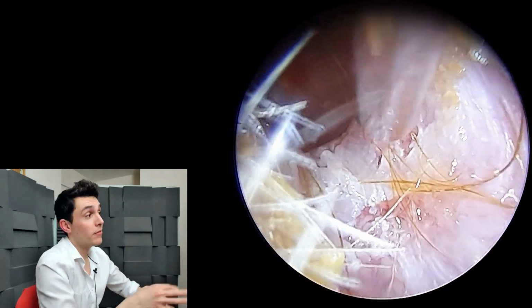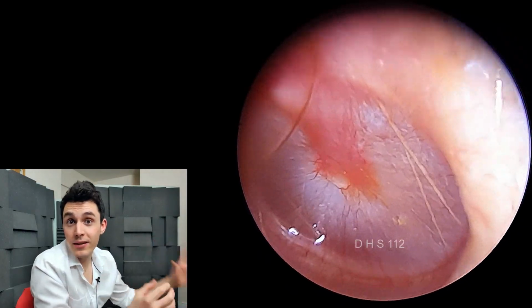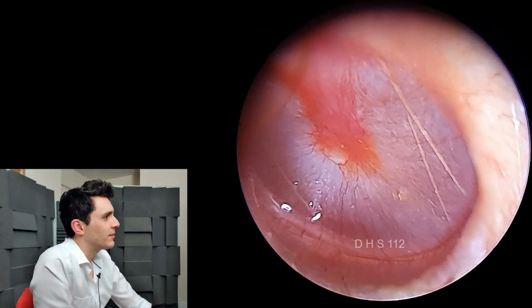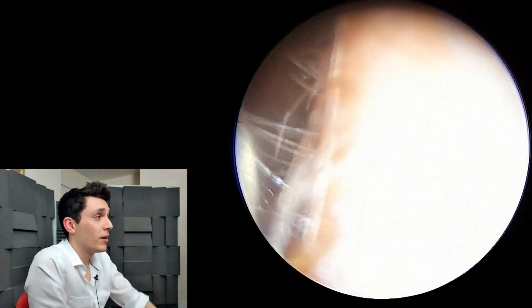So we're really just trying to prevent any kind of further infection. And consequently, after I performed this procedure, I popped the hearing aids back in, and he was in the land of the living. He could hear again, which he was extremely pleased about. So a little bit of fluid there, that's just some residual sodium bicarb, so nothing to worry about there. But there we go. I thought that was quite a nice procedure.